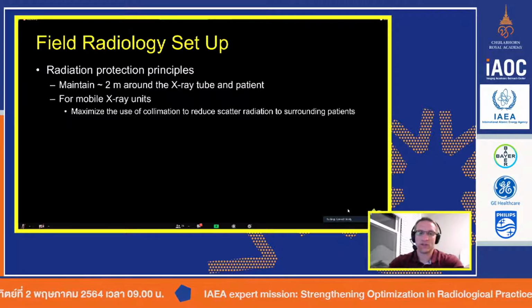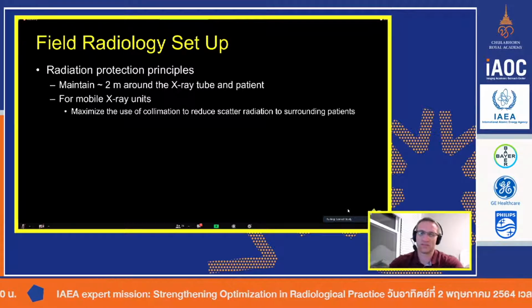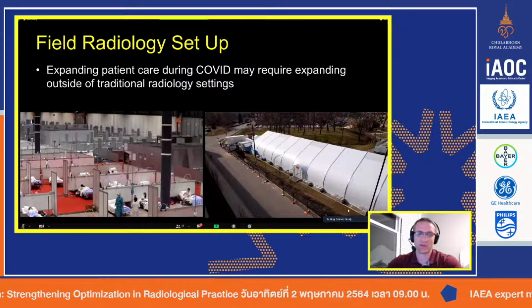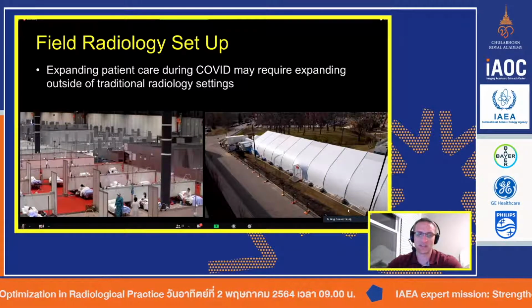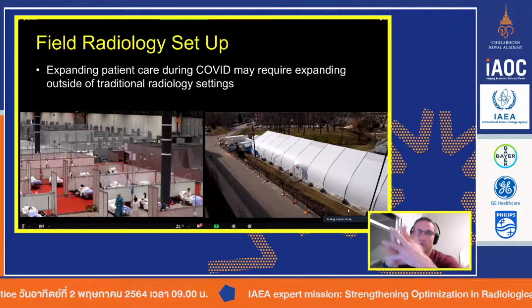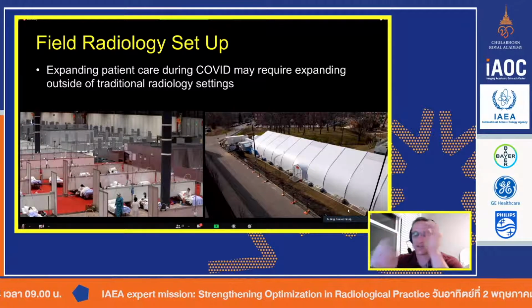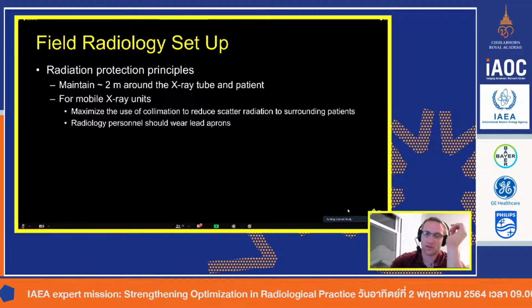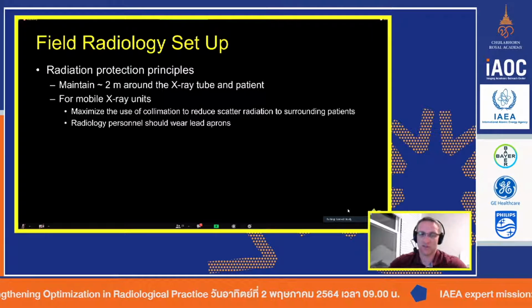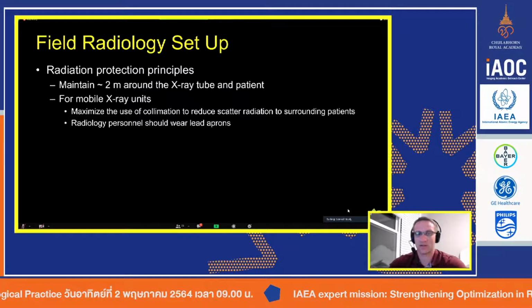So for mobile X-ray units, we're going to maximize collimation. In these situations, if we're literally rolling from setup to setup to setup, they're not really rooms, you will actually not be shooting through anything. It's not an image through protocol. And because of that, you can set your lighting and your collimation very good, because you should be able to get pretty close and get within your normal techniques. So do your very best to collimate, because the better the collimation, remember, less scatter comes off.